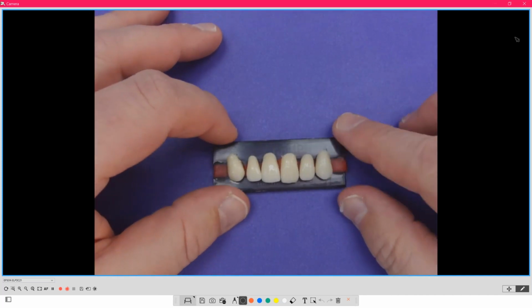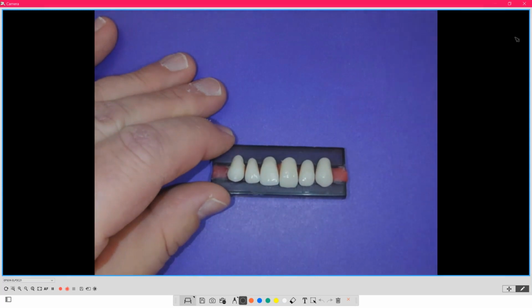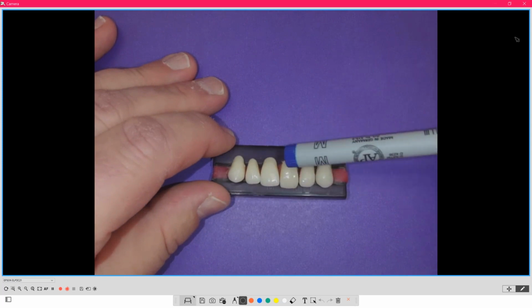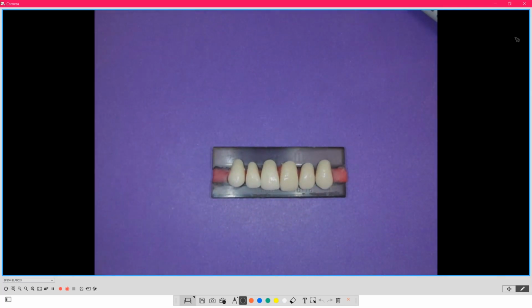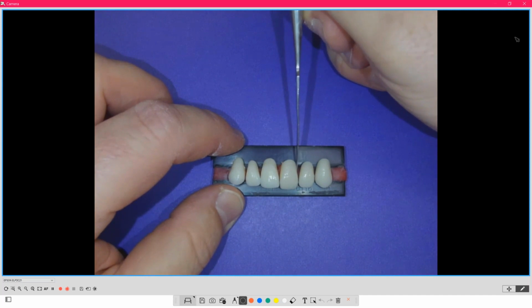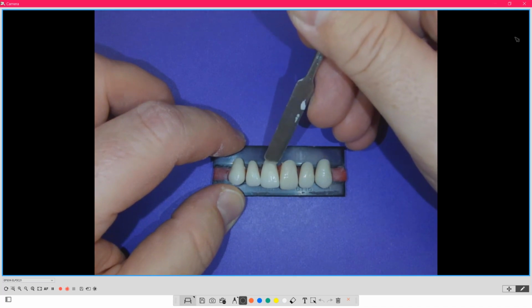Okay, so now I have this card. We saw this card before in the PowerPoint. On it, this side is our Dentsply, and this is Excel. The biggest change is, again, Excel will be a little bit bigger in the neck area, so it has a little bit more of a profound neck to, again, hide metal. It's got a larger neck surface and a thicker incisal edge. You don't have a collar anymore. The collar was put there for us to put the wax up to.